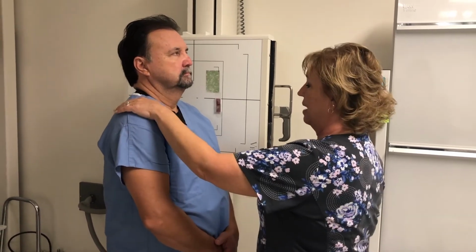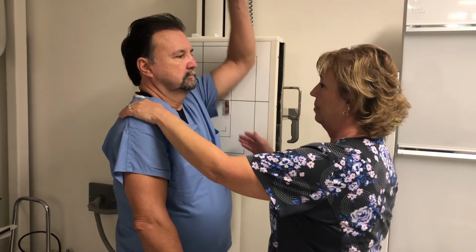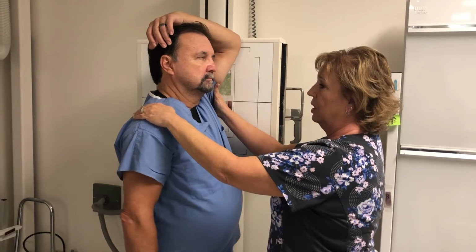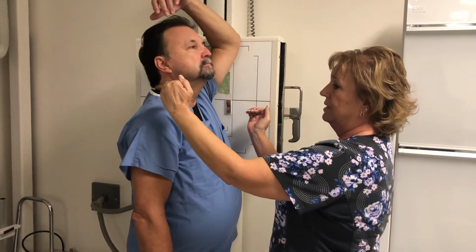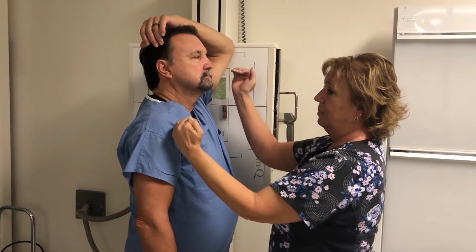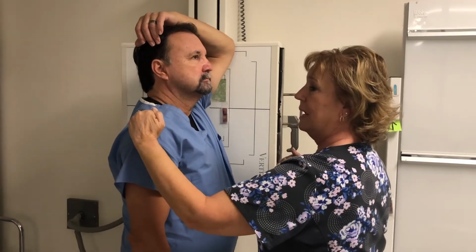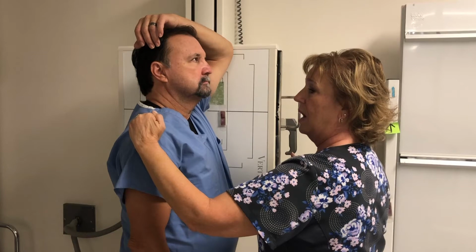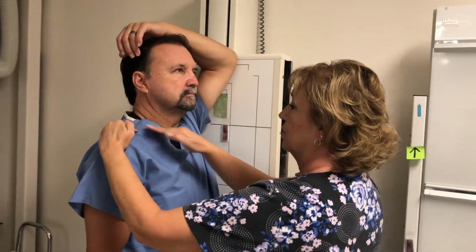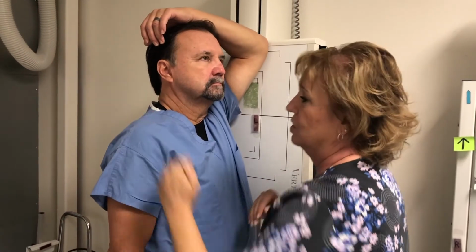We'll talk about it more when we talk about thoracic spine, but in conjunction with a C-spine, I would have him raise his left arm above his head. His right arm is now below, and what we've done is taken the humeral heads and separated them. So now I should be able to see over the top of his right shoulder and underneath his left shoulder and see the C7-T1 junction.